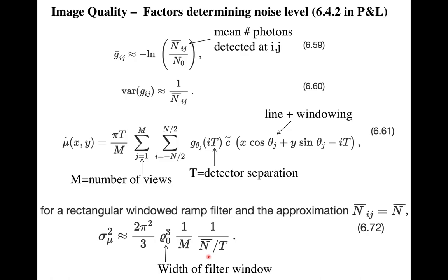That becomes particularly important when you're imaging kids, right? So if you have a small baby that's got a congenital heart abnormality, but you really need to see where all of the tubes are connected in order to plan the surgery, so that kid actually needs a CT, then you try and get that CT done with as few photons as possible.